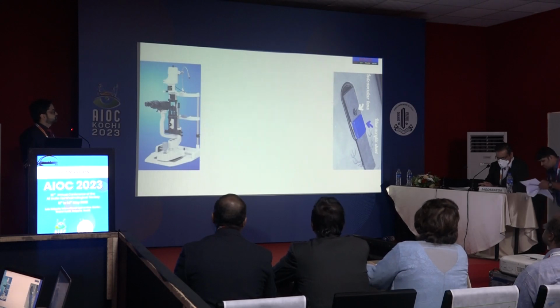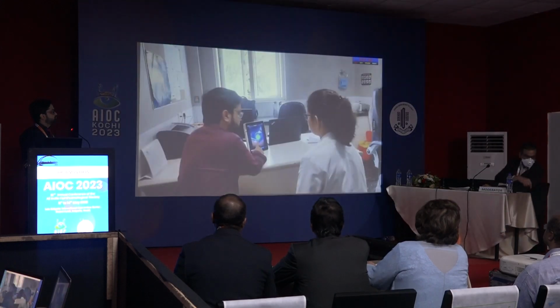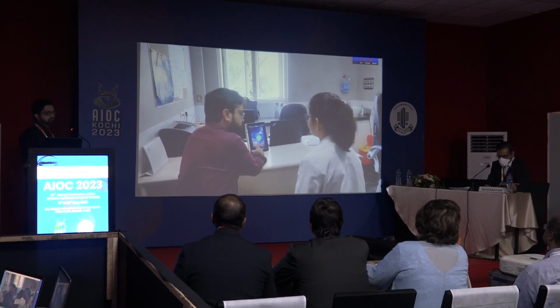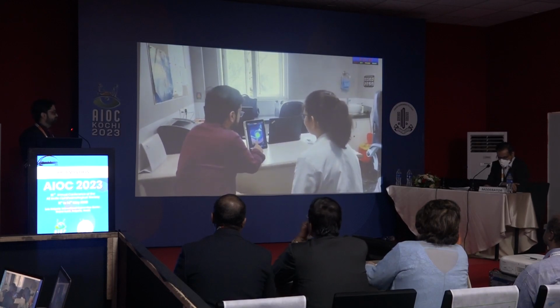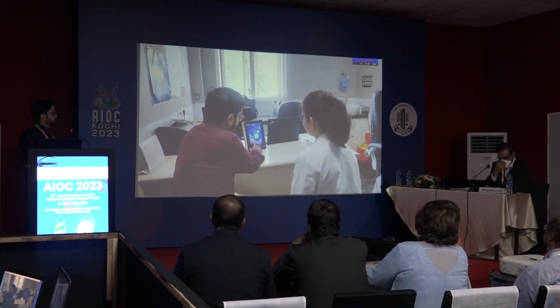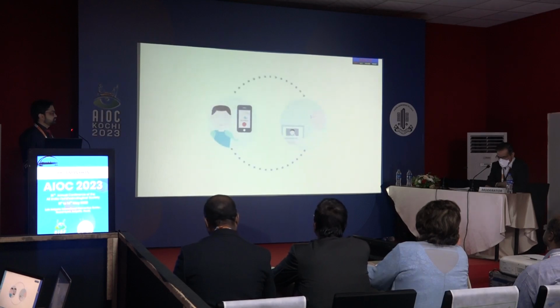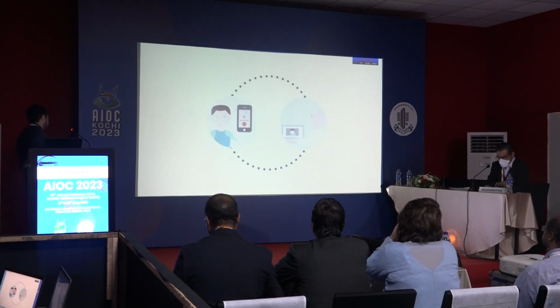We found that the image quality and diagnosis of contact lens fit was comparable between the two photographic devices. We found this device particularly useful as a teaching tool where recorded videos and pictures could be simultaneously viewed by the teacher and optometry or ophthalmology students and discussed. It could also be considered in teleophthalmology, where images and videos captured can be transferred electronically to be assessed by an experienced professional for further discussion and management.